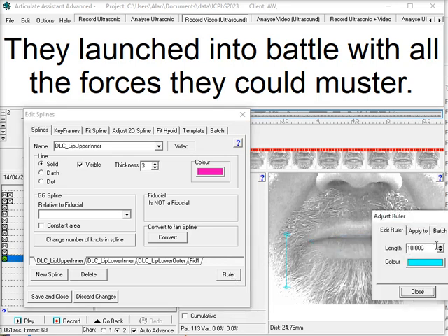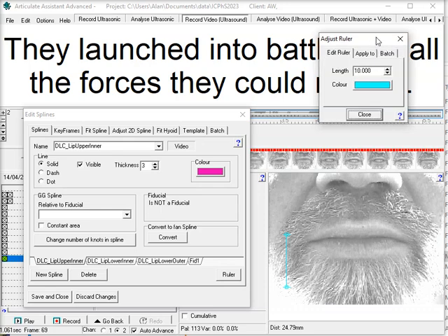So if you click ruler, we get this little sub dialog box, and you'll also see on the display now there is a cyan line, and we can click and drag the ends of that line to, for instance, stretch from the top of the image to the bottom of the image. If you had a ruler, you could stretch it from a marking that said 1 centimeter to a marking that said 8 centimeters or whatever, and you'd know what that distance was.